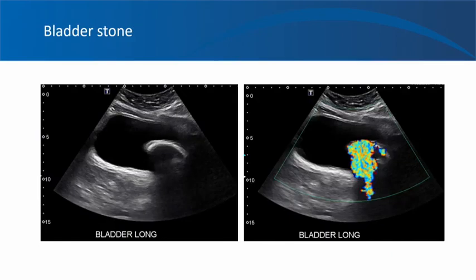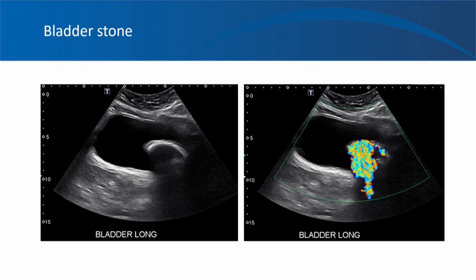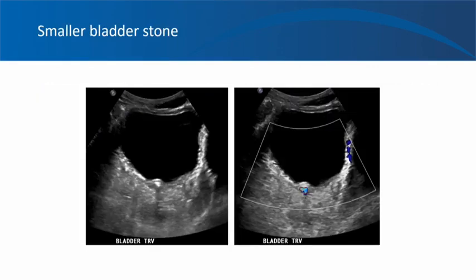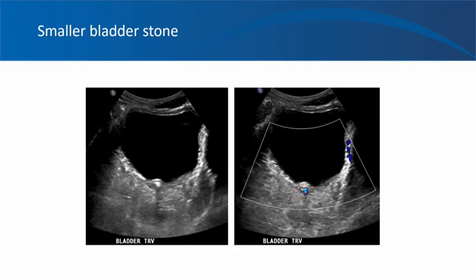This is an example of a big bladder stone with a horseshoe shape and shadowing; on color Doppler, you see nice twinkling all around the stone. If you don't have color Doppler, you can differentiate a stone from a clot by turning the patient into a decubitus position — the stone will move with the patient. Here is another smaller bladder stone that can be easily missed because the posterior aspect of the bladder is frequently bright due to acoustic enhancement, but color Doppler shows twinkling, confirming it as a bladder stone.